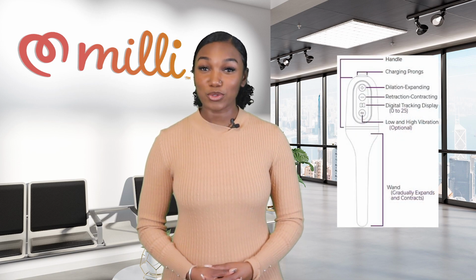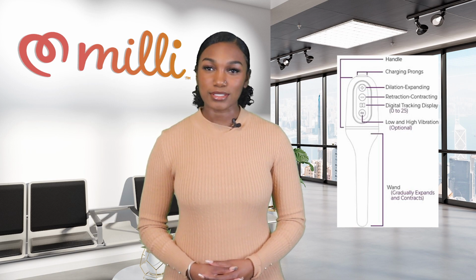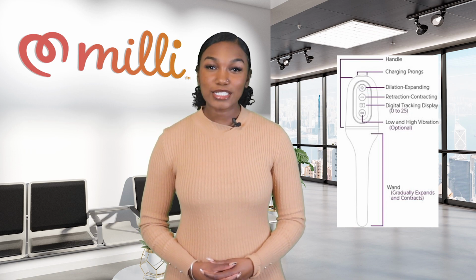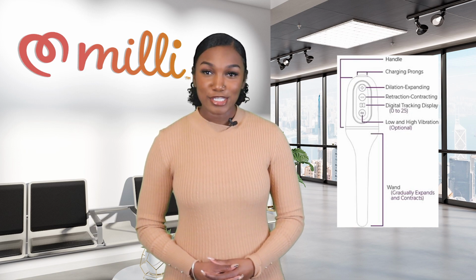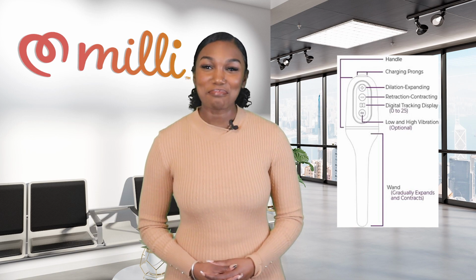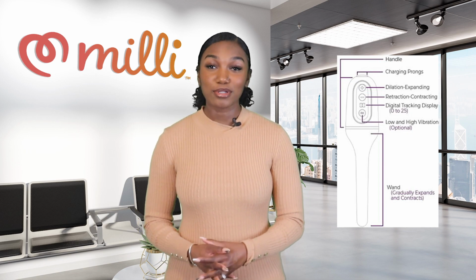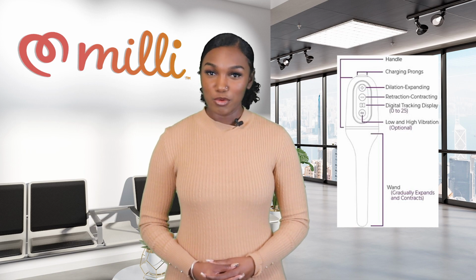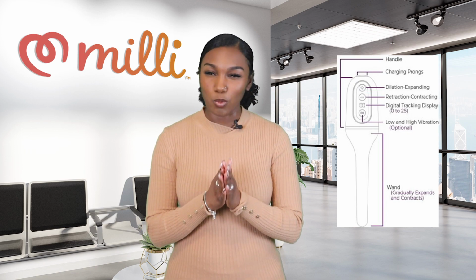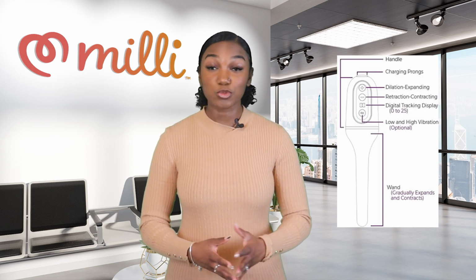Your Milli device has a handle and a wand. At the very top of the handle, you will see two tiny prongs. These prongs line up with the charging contacts in your case. The first button below the charging prongs has a little plus sign, and this is what you'll press to expand the wand by 1 millimeter with each press. The next button has a minus sign, which will retract the size of your wand by 1 millimeter with each press. Below this is a digital tracking display. When the wand is at its smallest size, the display will read 0, and it will increase by 1 with every push of the plus button until you get to the widest diameter, which will read 25.